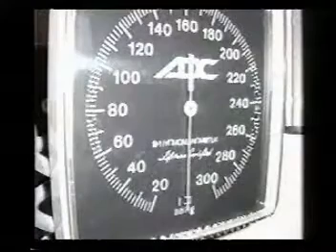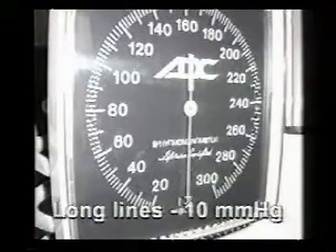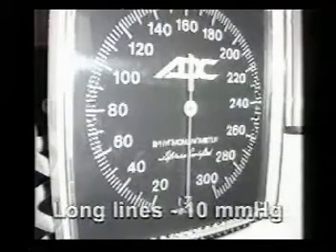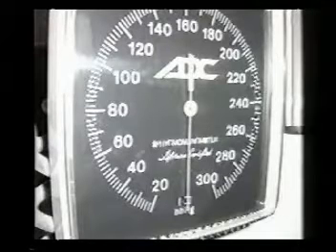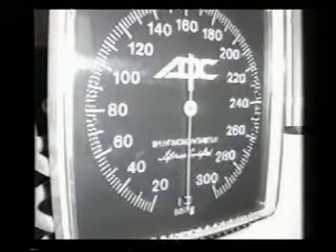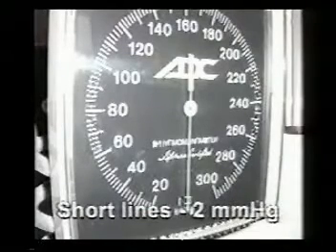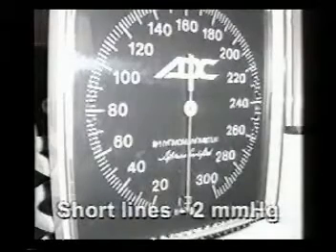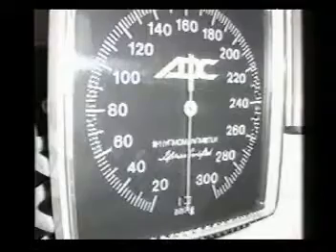The gauge is marked with a series of lines. The large lines are at increments of 10 millimeters of mercury pressure. There might be a number next to that longer line, or there just might be the line itself. The shorter lines represent 2 millimeters between each one, so it's 2 millimeter intervals.